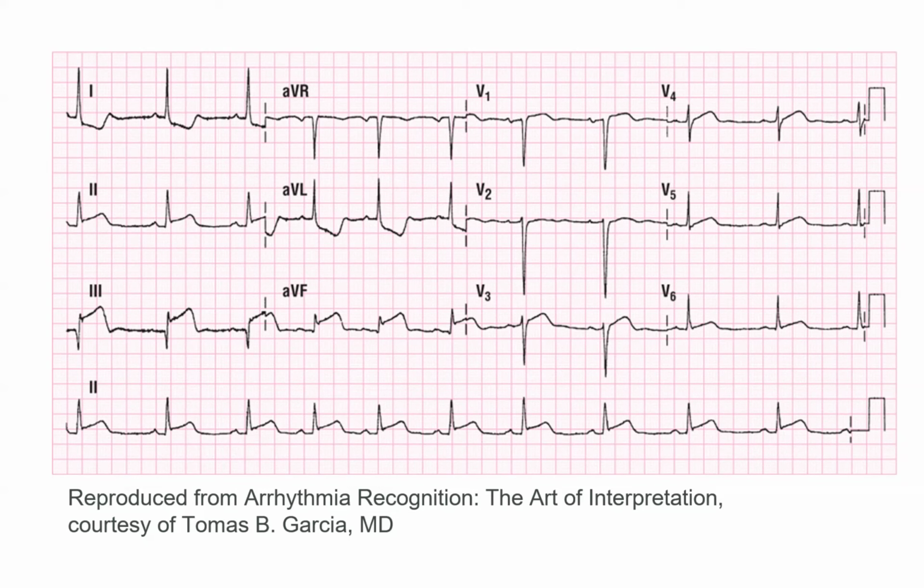Nate? So now you move V4 to V4R, what's that going to look like up there with this? It'll look just like this, except that if V4 is involved, it doesn't say R, you physically write R on there. It'll look like maybe this. It'll have elevation.